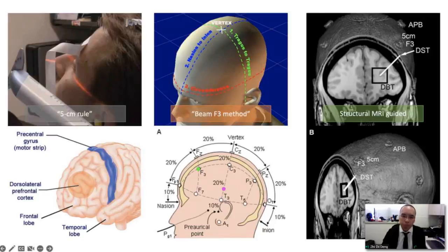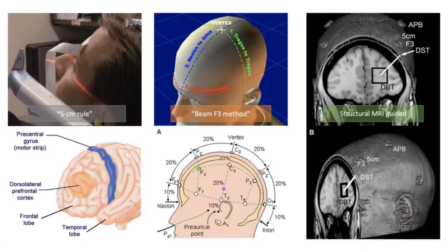Next slide. As you well know, I think most of us on the panel generally agree, or maybe even universally agree, that current targeting approaches used for clinical TMS are considered suboptimal. The 5-centimeter rule does not account for individual variation in head anatomy or head size. And no matter how well you do it, even when some systems provide laser guidance to measure this 5-centimeter quite precisely, it often selects spots that are outside of the DLPFC.